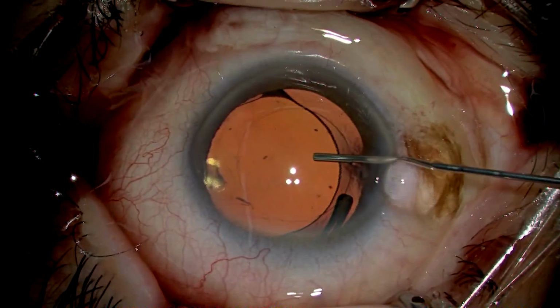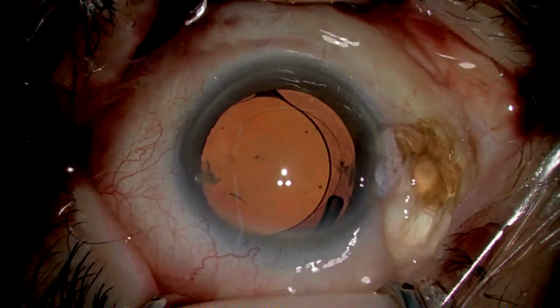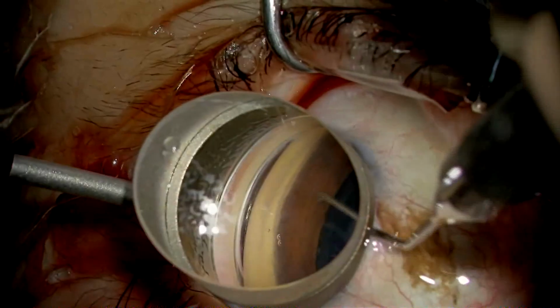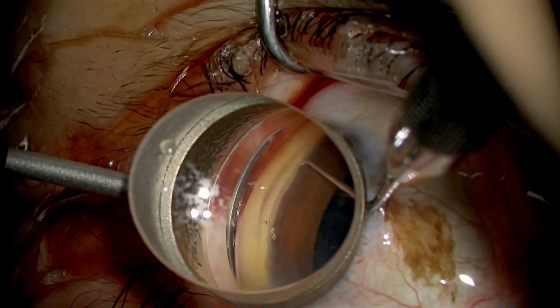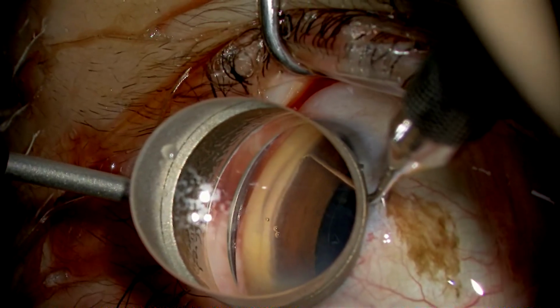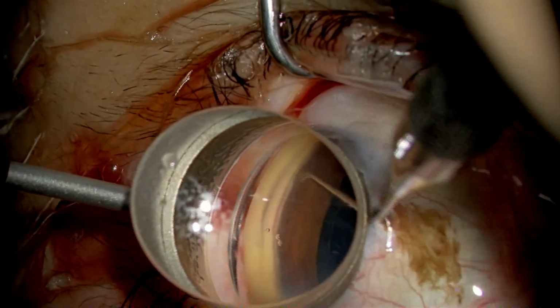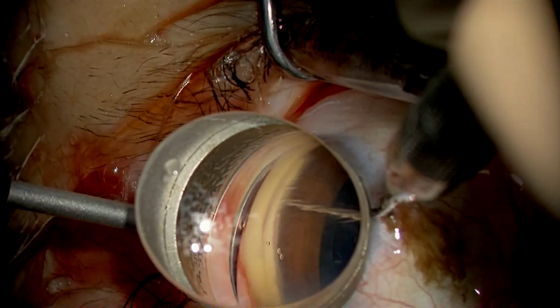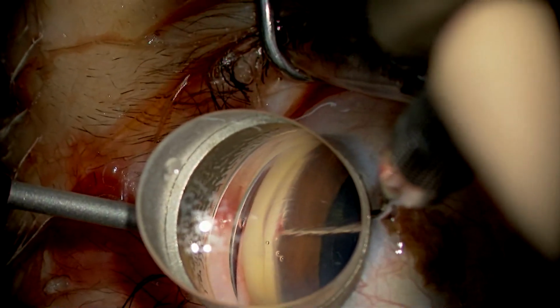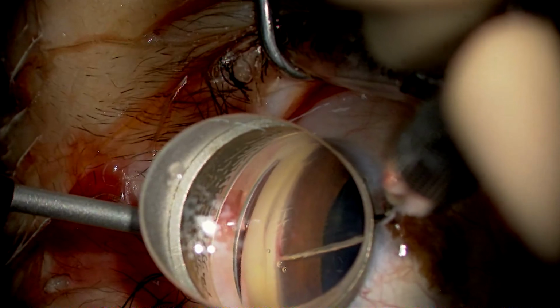This shows how the TMH is used in this surgical technique. After injecting OVD into the anterior chamber to stabilize, with a gonioprism lens to observe the temporal angle, the tip of the microhook is inserted directly into the Schlemm's canal and moved circumferentially to incise the inner wall of the Schlemm's canal and trabecular meshwork.